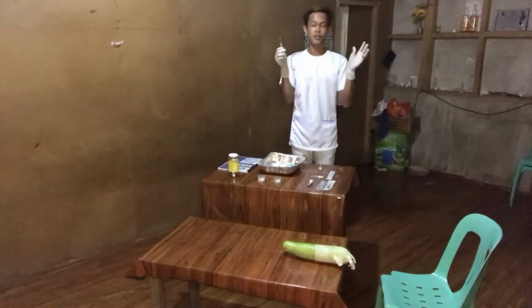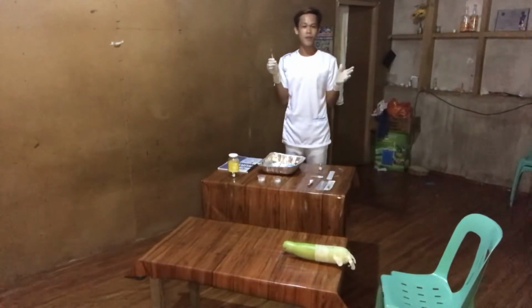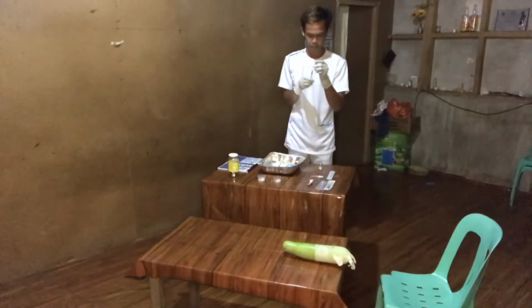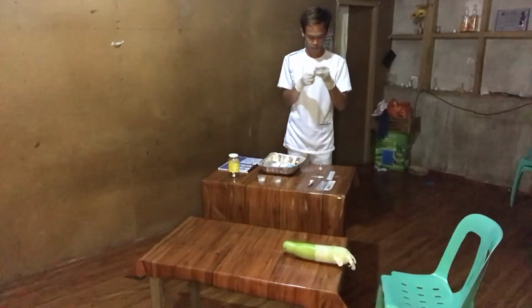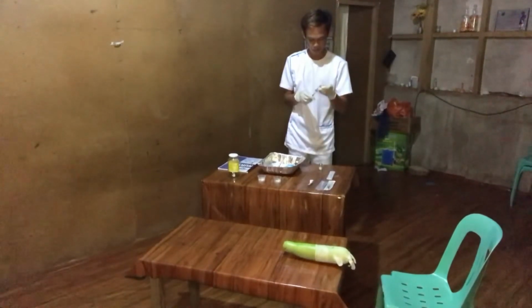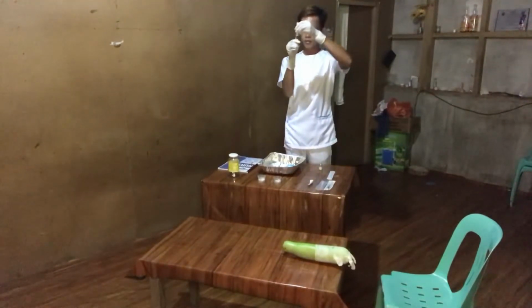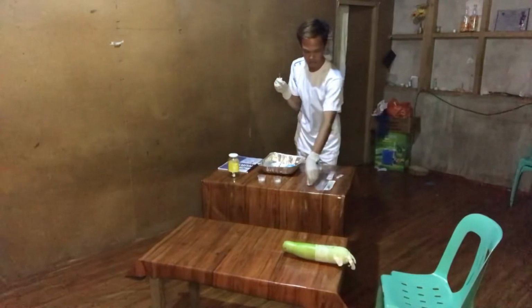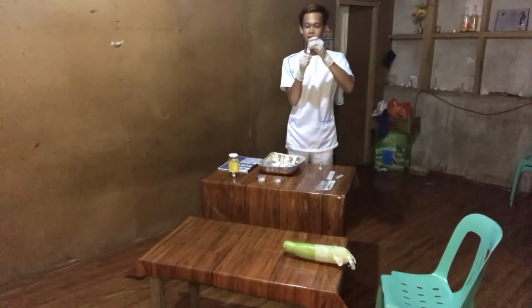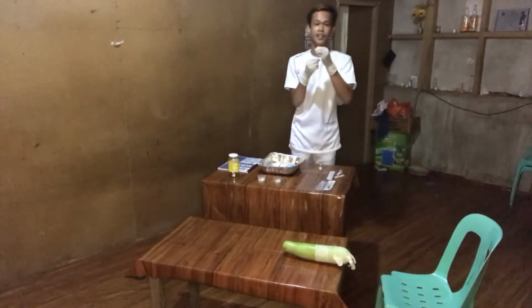Tap the barrel to remove air bubbles. We have to remove the aspirating needle and replace it with a new one. Secure that the connection is not loose.